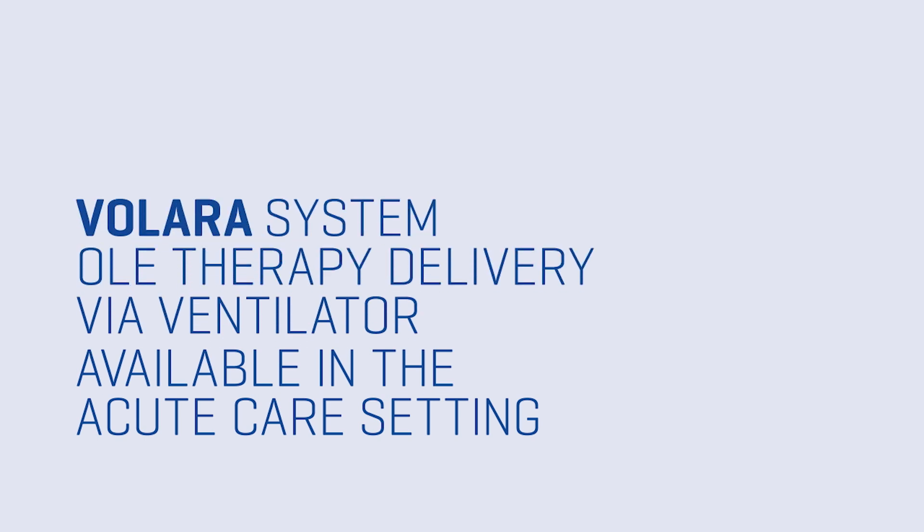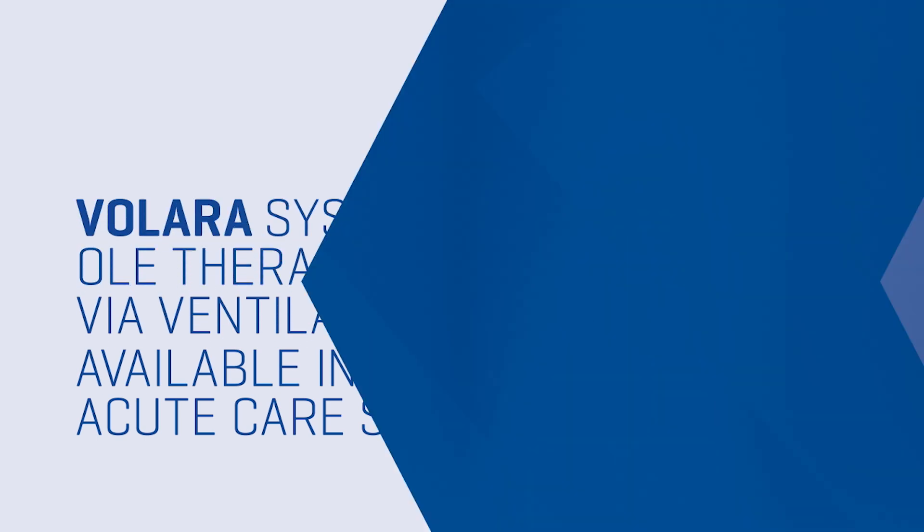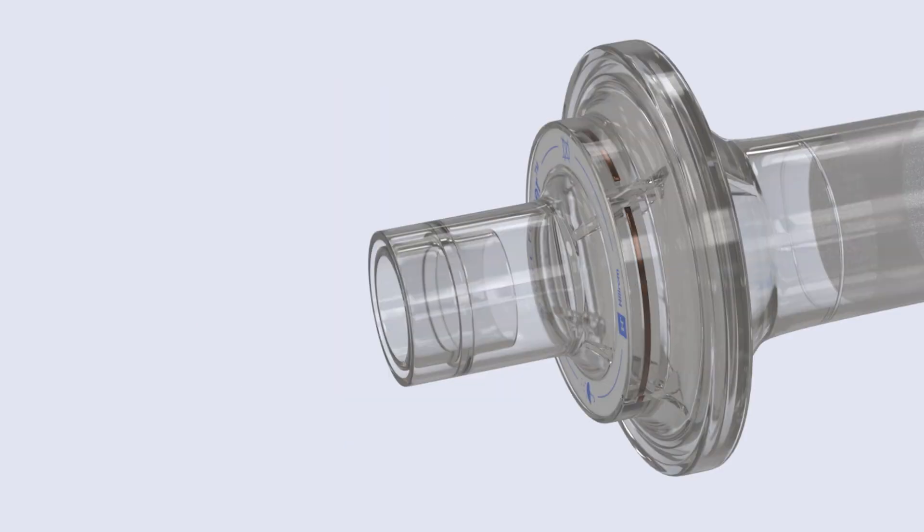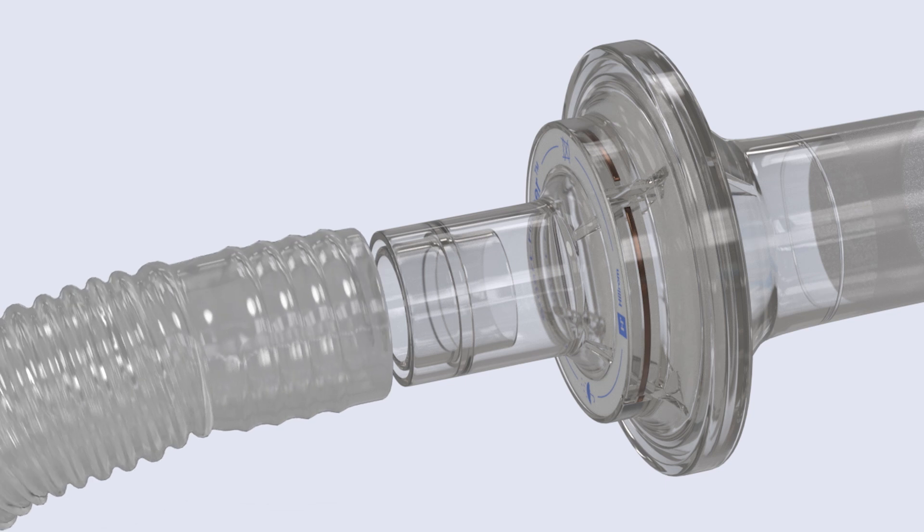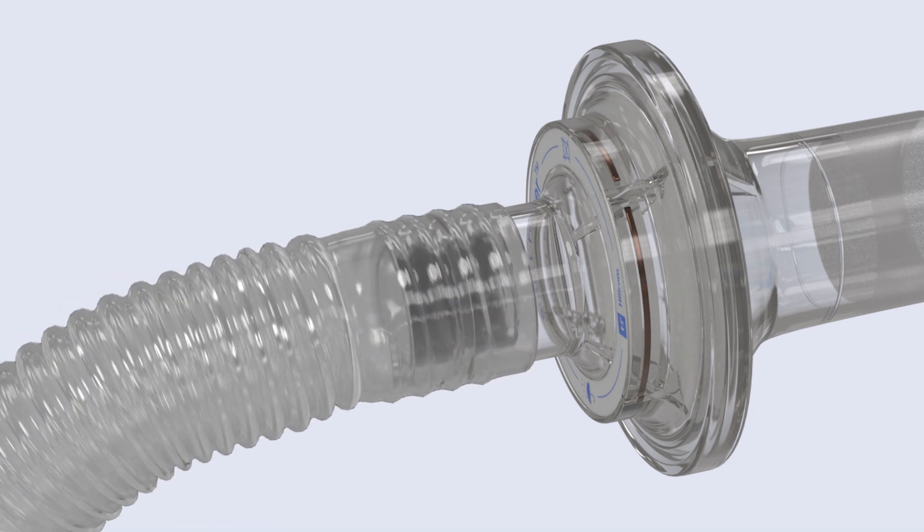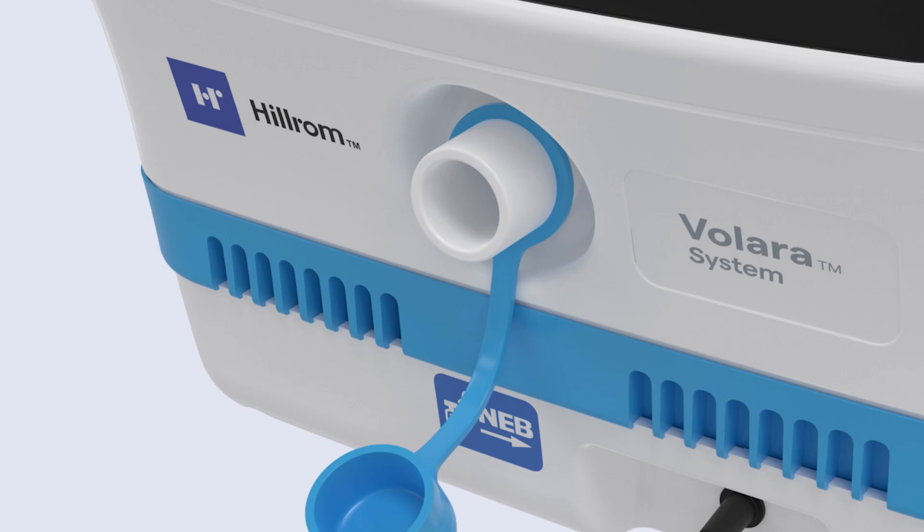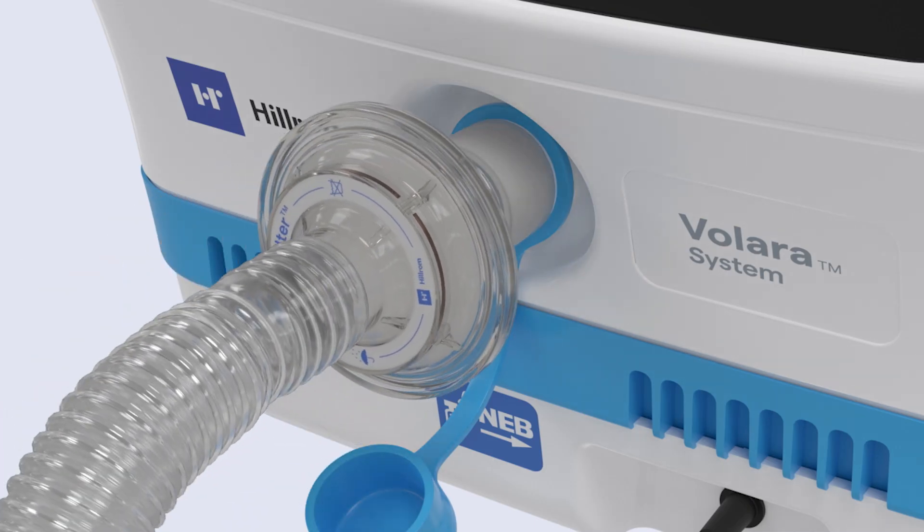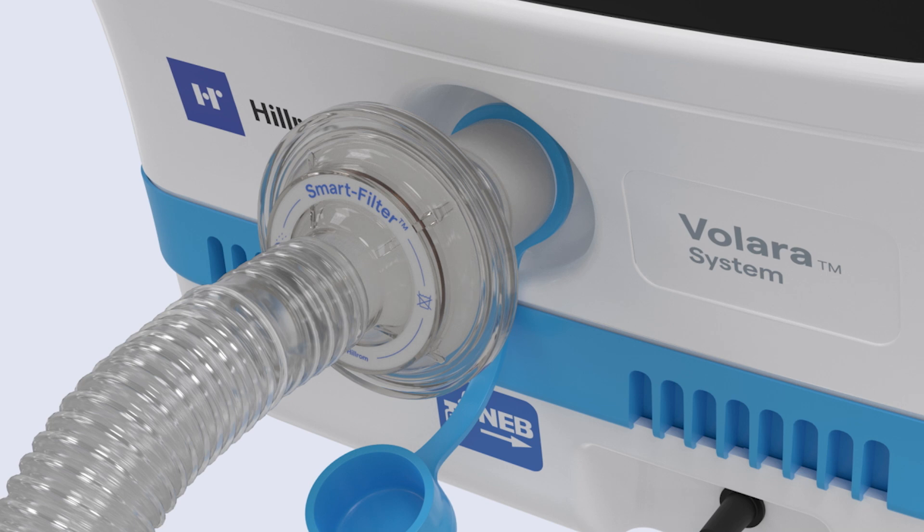Assembly is similar in the acute care setting, but this circuit uses the blue ventilator adapter instead of the clear spontaneous breathing adapter. Begin by confirming the connection of the breathing hose to the small end of the smart filter. Then align the large end with the therapy port, gently turning to secure.